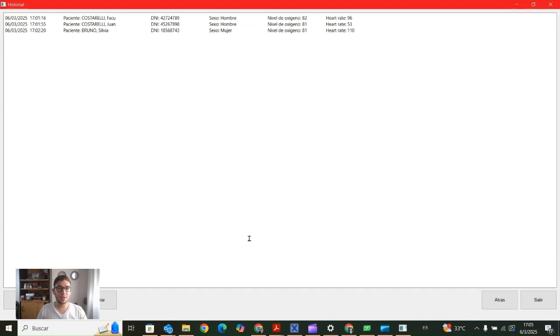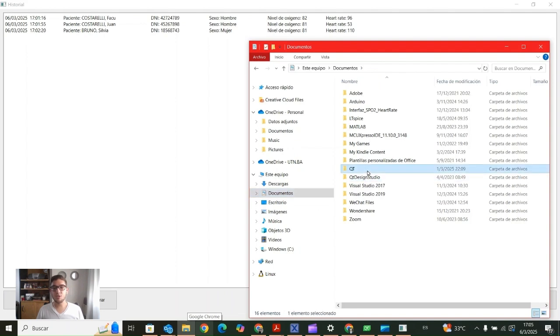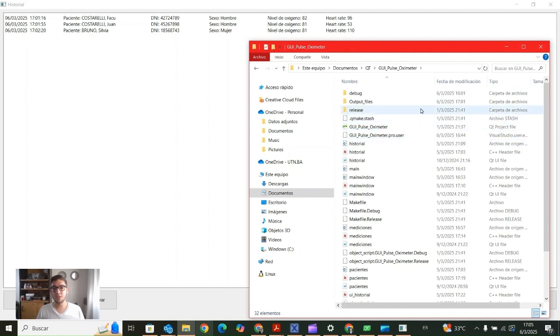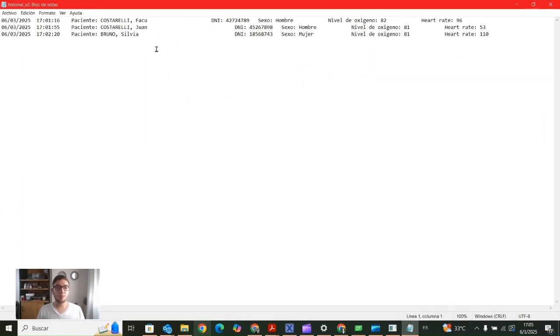We can save the measurements, and also we can see them in an output text file, okay, that is located in documents, QT, in the same folder that I have saved the graphic user interface, and the folder is called output files. You can see this .txt file, and we can have the same information that I showed you just a few moments ago.